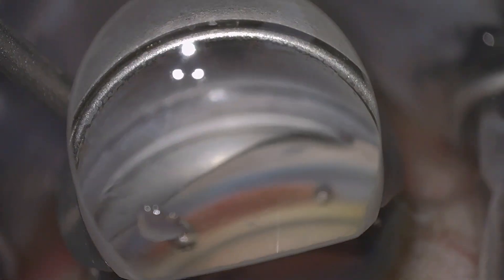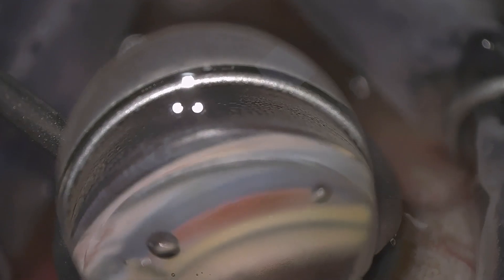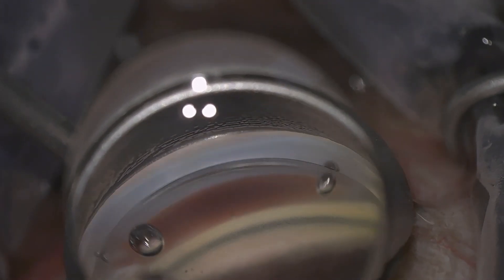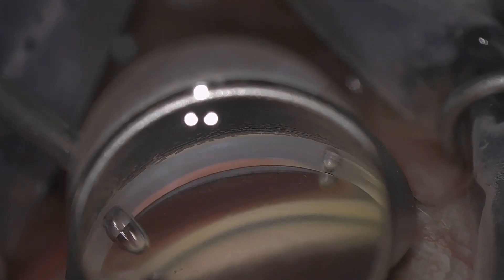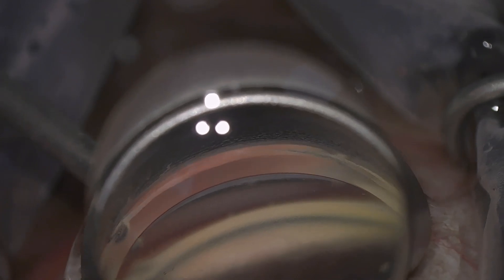And one of the questions I always get asked is, how much viscoelastic should one put in the eye? And I think that with the iStent Inject delivery system, I think you perhaps need a little bit more viscoelastic than you did with the original G1.